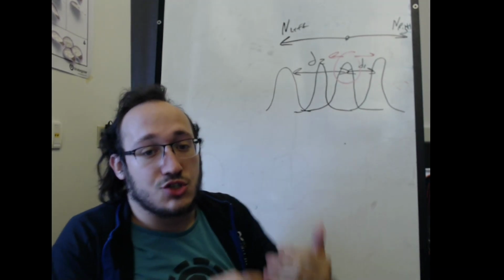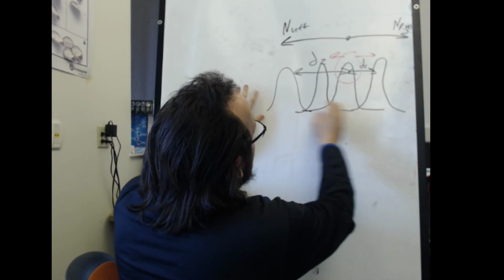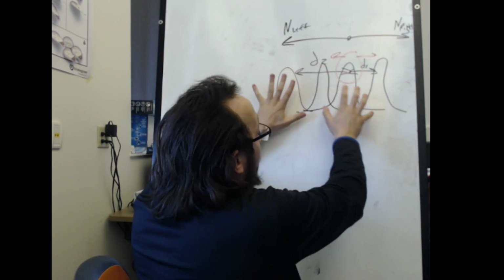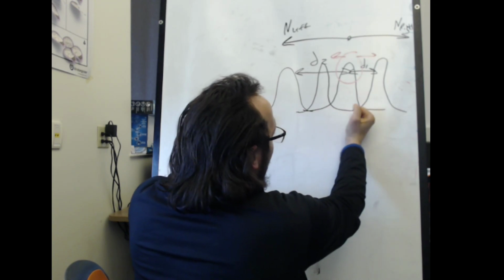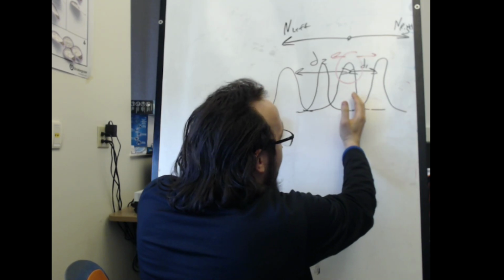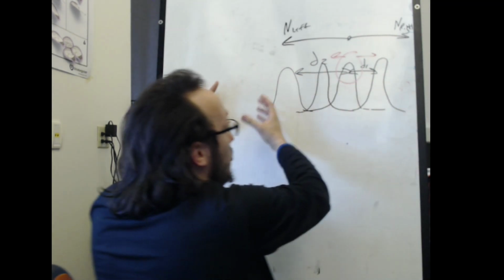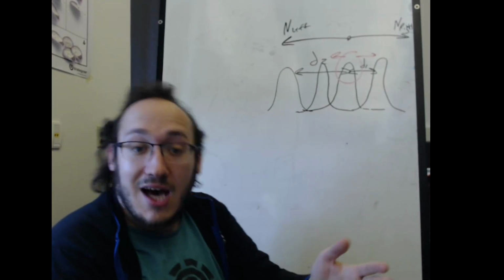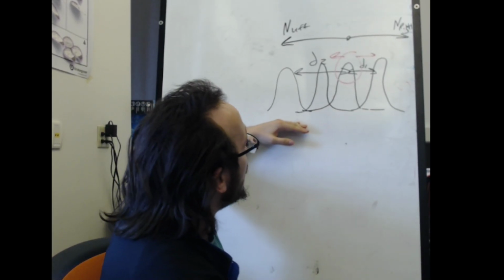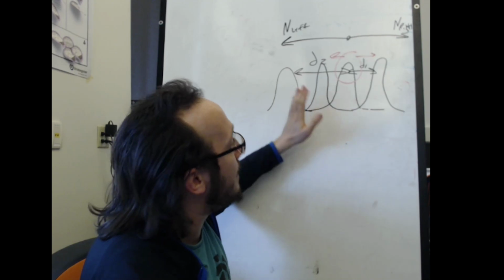Now, how you do this is you record for longer than the length of this signal, and you have a little bit of space before when the signal occurred that you can also include. So that way, you can take the signal and basically chunk it before when the event occurs, but make sure the event is still within that slice, and also shift it forward to just after when the event occurred. As a result, this temporal change, or change in time, that will happen over the course of the signal can be accounted for, and so you shouldn't get as low accuracy when you try to perform classification if you include a bunch of shifted samples.